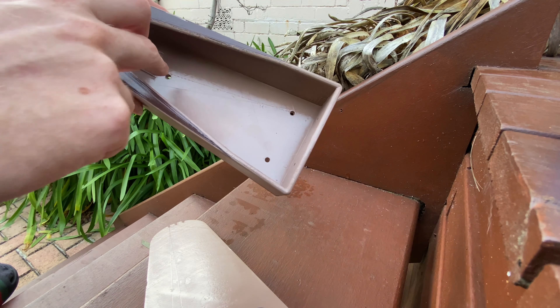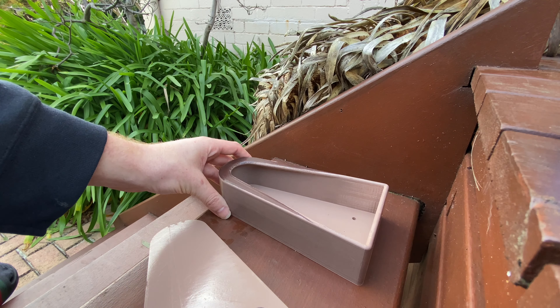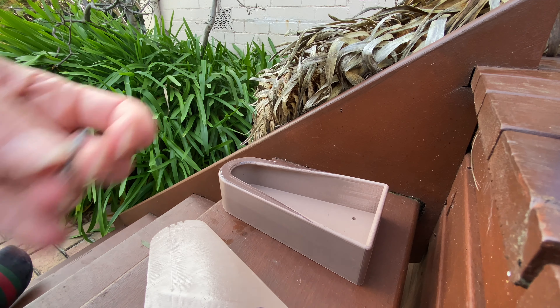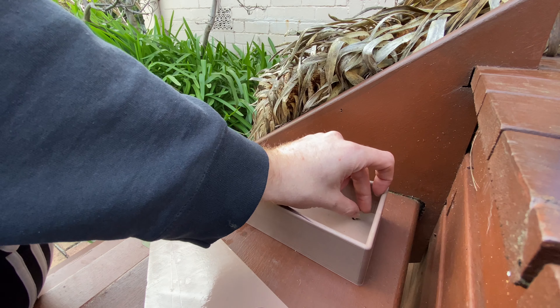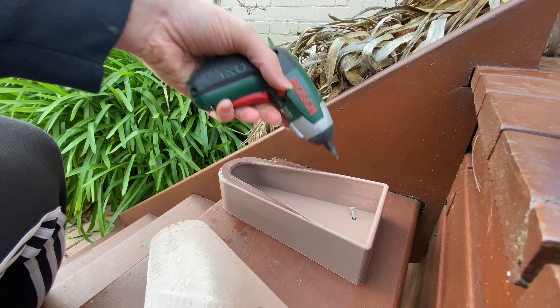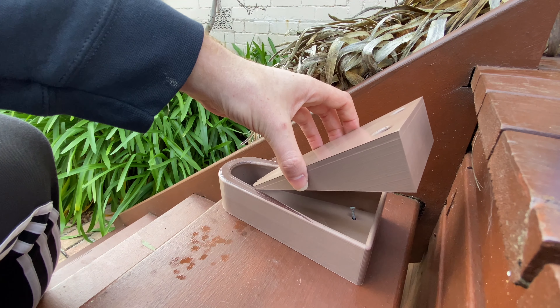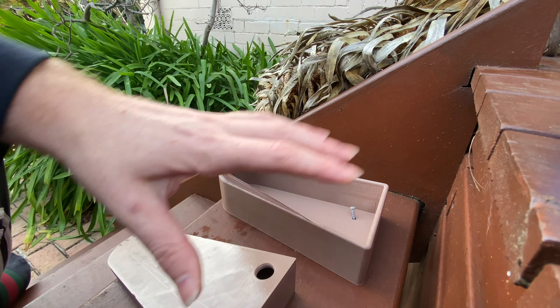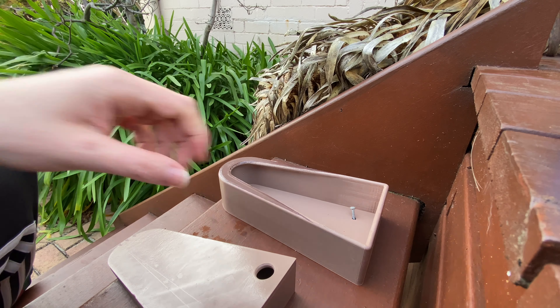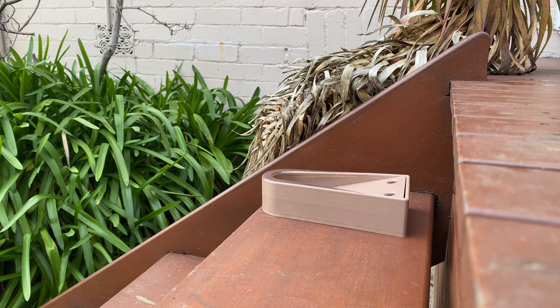With simple three screws on the bottom and two on the back, the device can just be placed in position and screwed in place. The device will then be secure and the ramp can then be placed inside at an angle, covering up all the screws, and will be rigid and in place and ready to work.